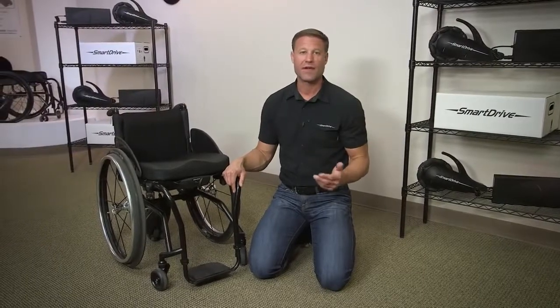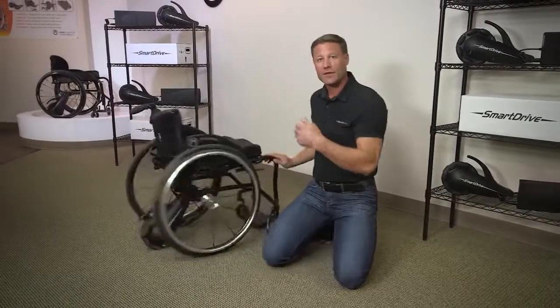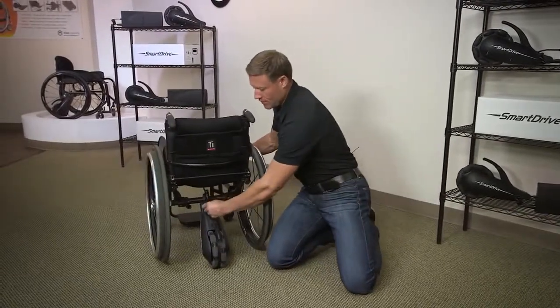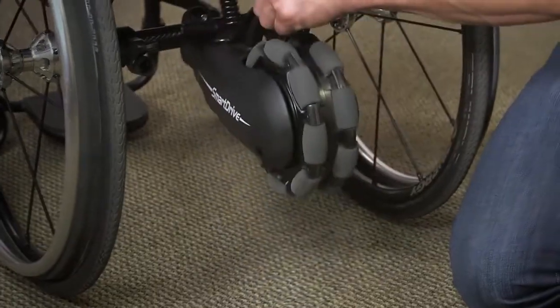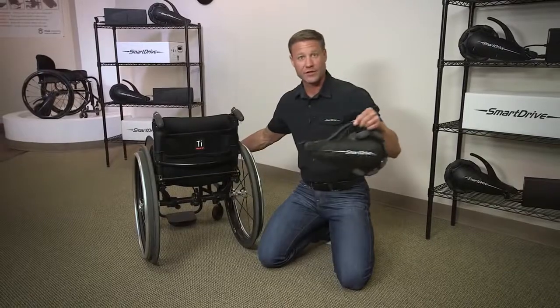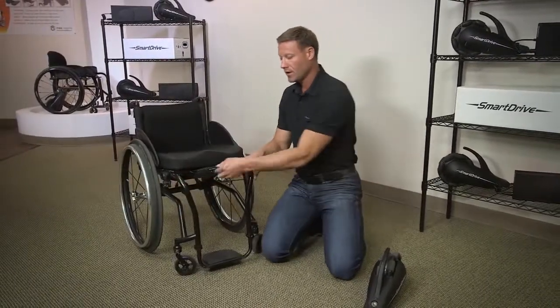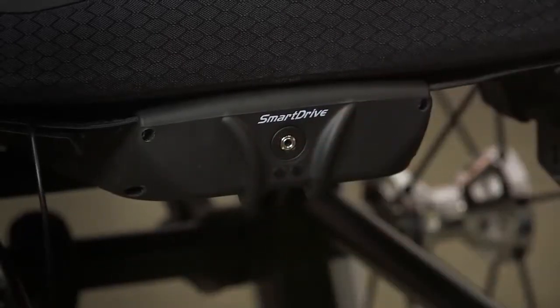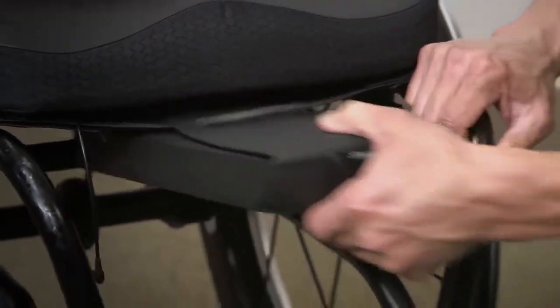The SmartDrive is ultra portable, and it's very easy to take off and put on. This way you can choose when to put it on and when to leave it off, depending on where you'll be pushing. First, we'll unplug the drive unit from the battery. So unplug by just pulling off. Next, you lift up on the drive unit and it will come off the hitch. Simple. Spin it back around, you unplug the buttons from the front of the battery. You then remove the battery by grabbing the front and simply sliding it out.